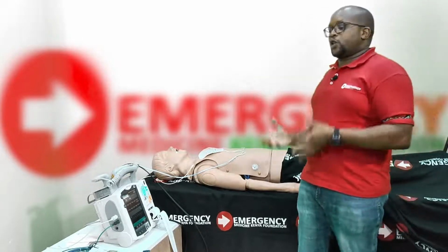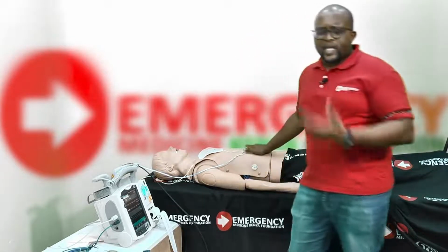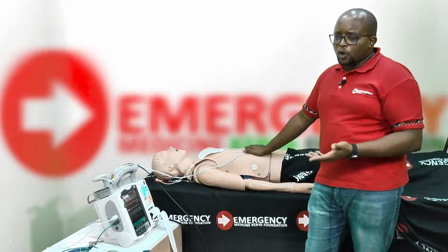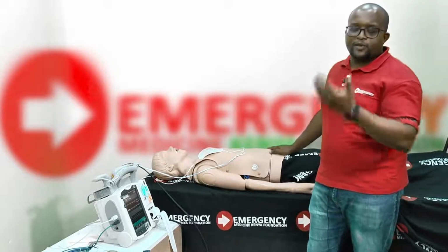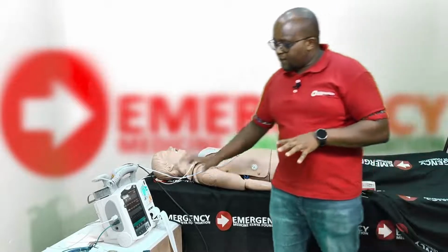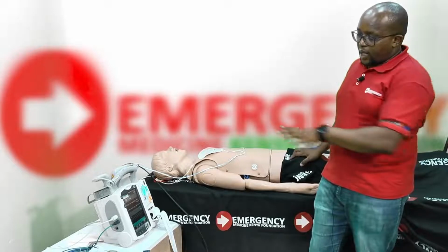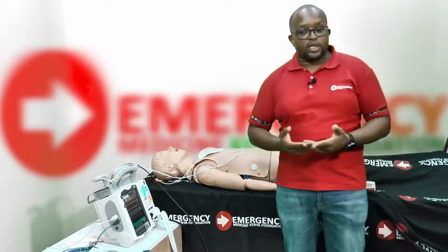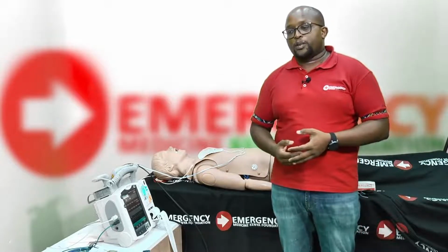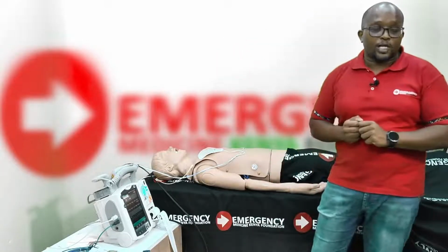The third capture is the physiological capture. So I'm going to check my patient's blood pressure, but when I check, the blood pressure is still low. I'm getting it at 60/40. Patient still has features of shock. So I have fixed the electricity. I seem to have fixed the beat at 70 beats per minute. So there are two options. My patient's blood pressure could be low because they're hypovolemic, in which case I will maybe give him a small bolus of fluid.